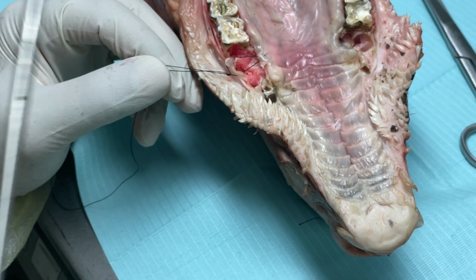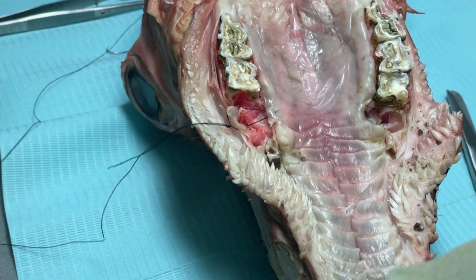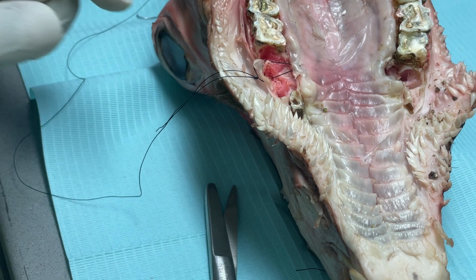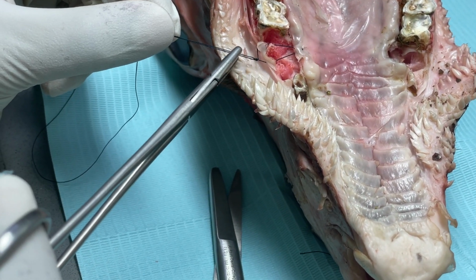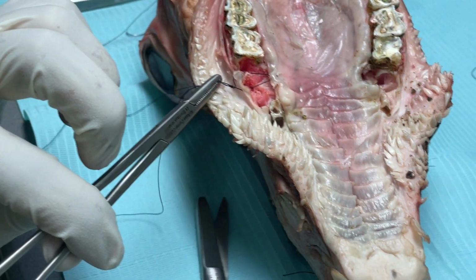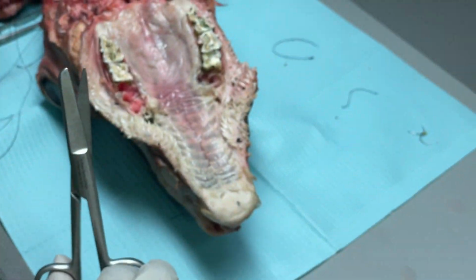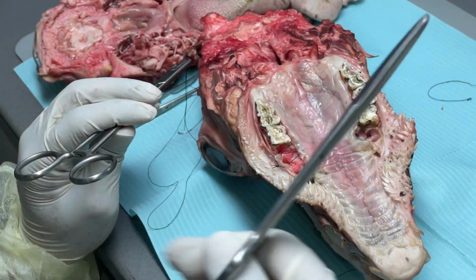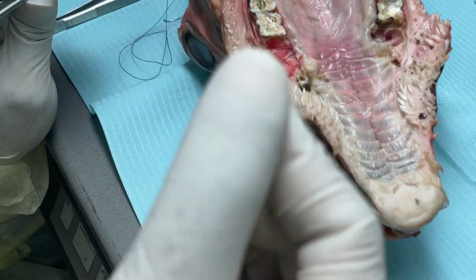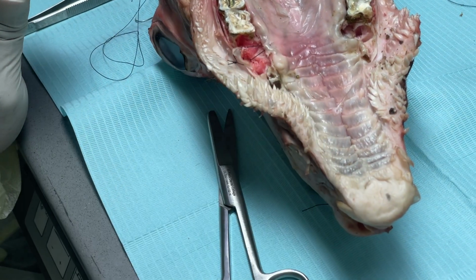Then see, when you're cutting, this also I'll show you. When you cut the free ends, instead of leaving it like this and taking the scissors and just trying to cut it, it is always better if you first hold both the ends, how much distance you want, say 4 millimeters, hold it, lock it, then you use the scissor, cut. This is easier, otherwise it might go here and there, difficult. Don't cut very small, because if it slips, it will just open up. So keep at least 4 millimeters. It should not be too long, should not be too short.